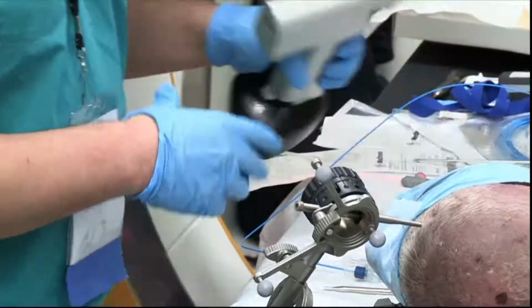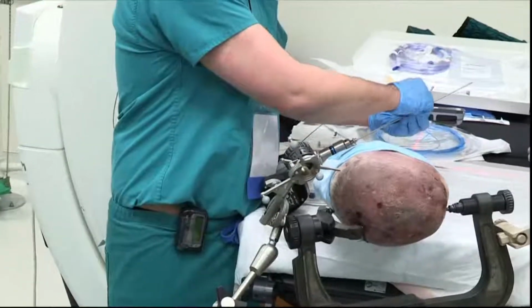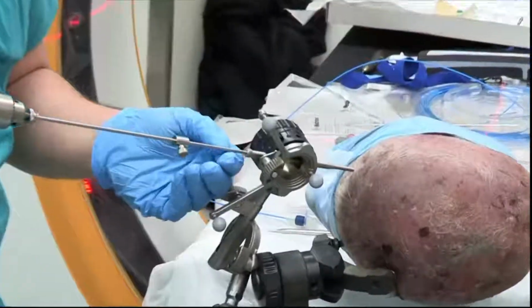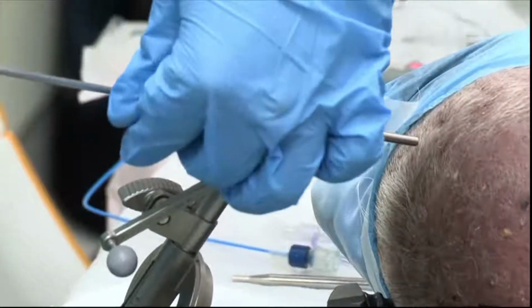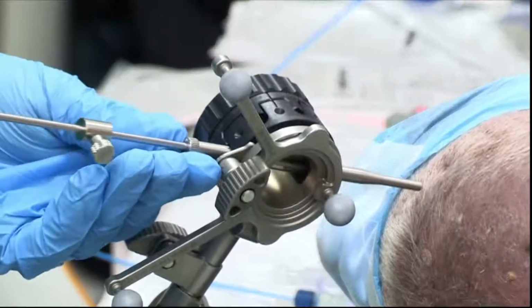Finally, after that's done, we come down and we use our drill, not this drill, but this bit. See if this will work. And once again, this takes you back to your initial training and putting in an EVD.